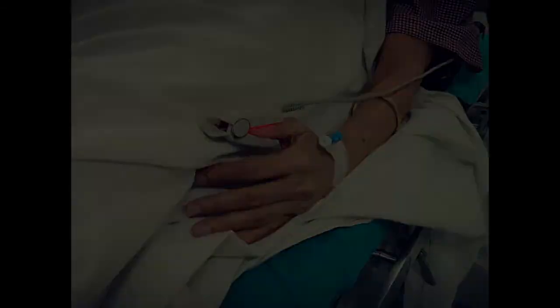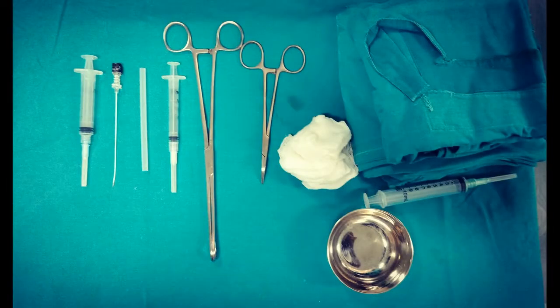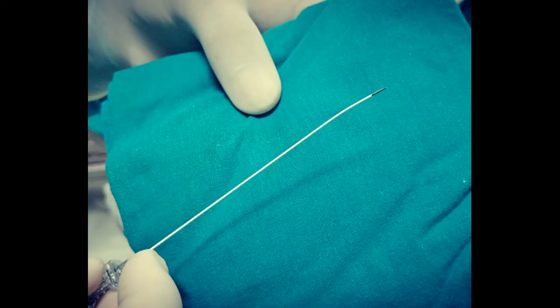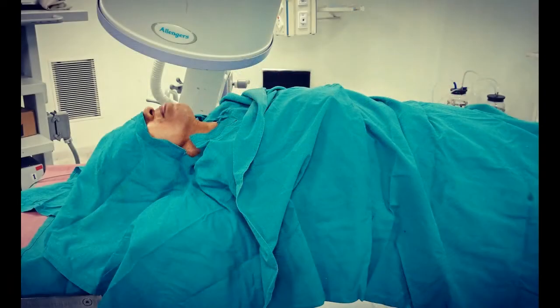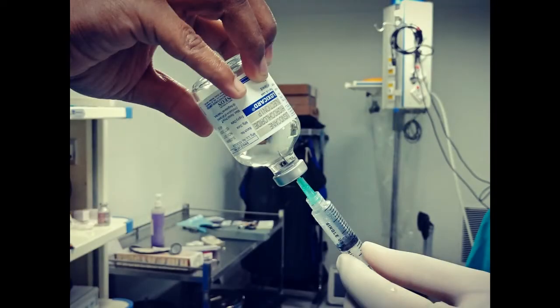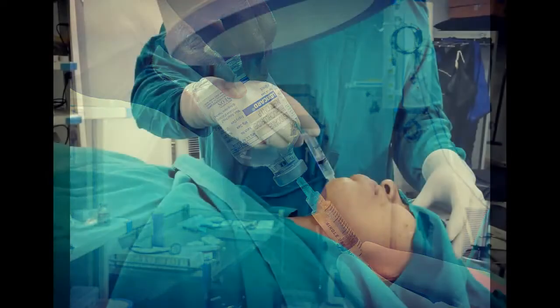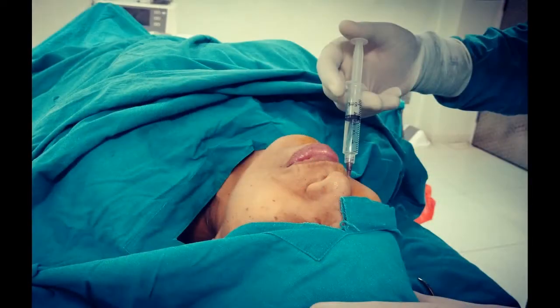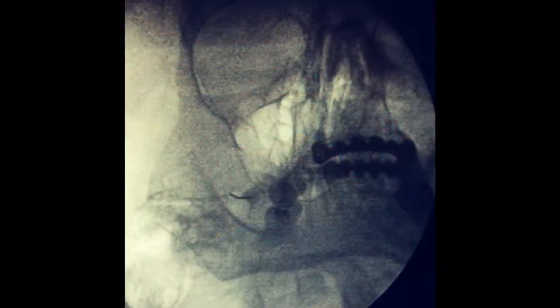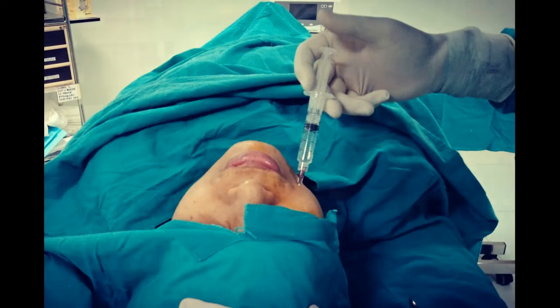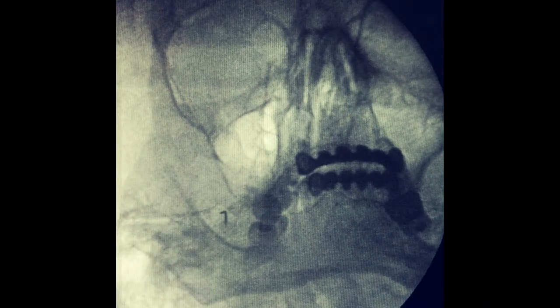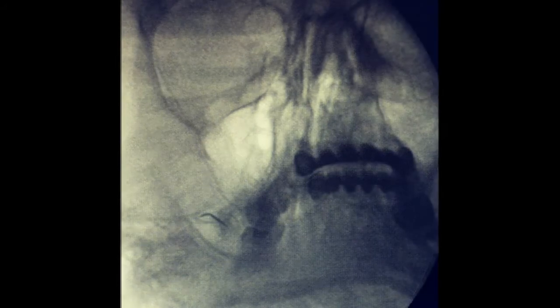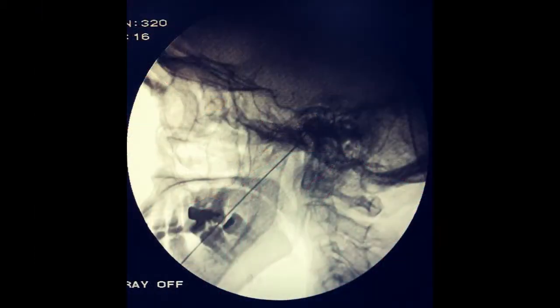Putting IV line with monitors, proper instruments — a 5mm tip 22-gauge RF needle — and drape the patient. Taking person's consent and giving local anesthesia at the needle entry point, usually 2 to 2.5 cm lateral to the angle of mouth. This is done entirely under fluoroscopy guidance. The needle will be placed in the lateral part of the foramen where the mandibular nerve is. For maxillary, go to the middle; for ophthalmic, go to the medial part of the foramen.